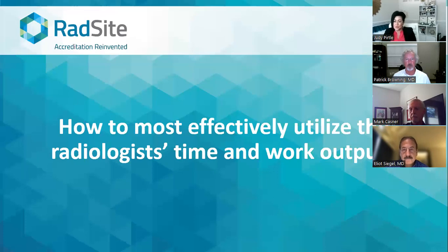So either that's at scheduling, technologist. I know that we require our technologists to check orders at a minimum the day before. We try to do it a few days out or a week out, as far out as we possibly can. And then from there, make sure that the diagnosis matches the order. We preach that. It's in our policy. We make sure that we are following the rules because we want to do what's best for the patient, right?